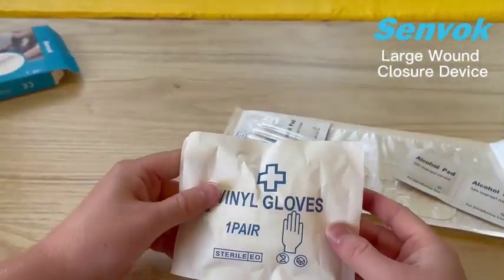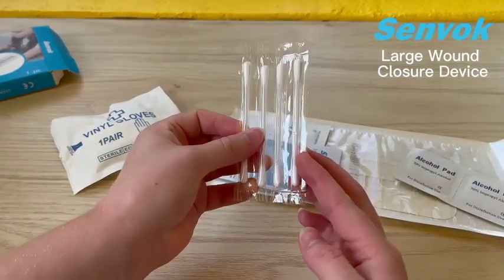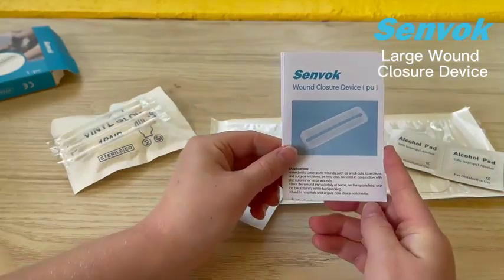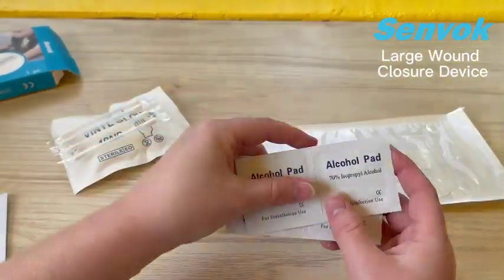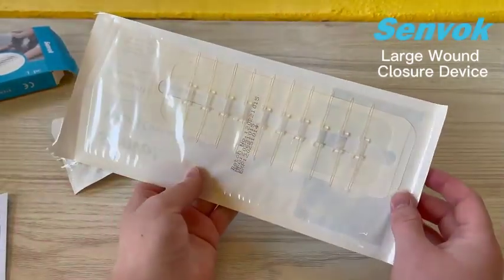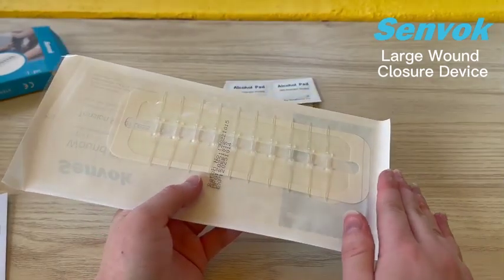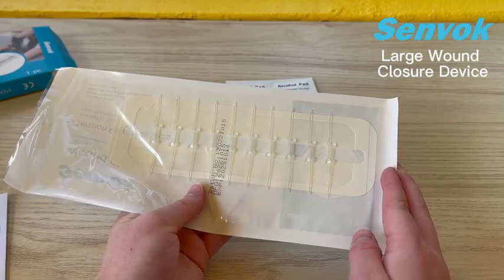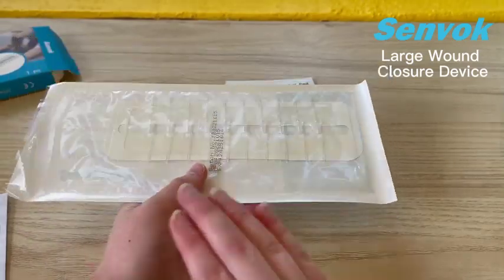So you can see that we have one sterile set of vinyl gloves. We have four double-ended sterile Q-tips. You have instructions on how to use if you need a little more in-depth guidance. And we have disinfecting isopropyl alcohol pads. This is a single pack — an extra-large wound closure device. This whole long bandage can go on a larger wound or a smaller wound. You don't have to use the whole thing — you can tighten it as much as you need, so it can close a wound up to this whole large section.